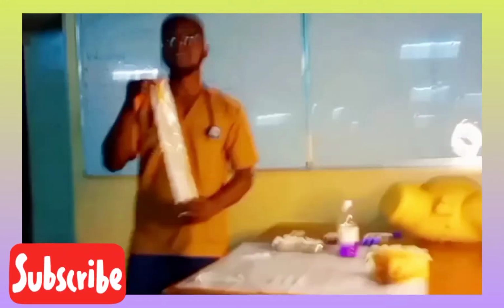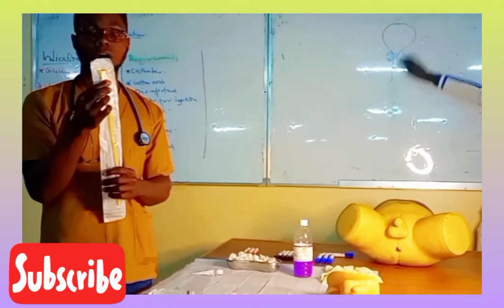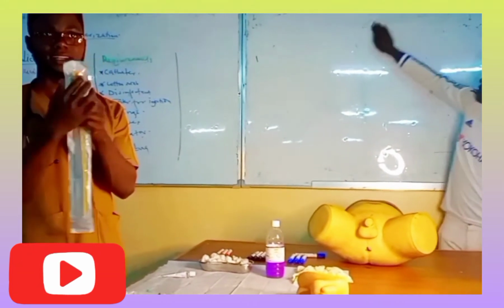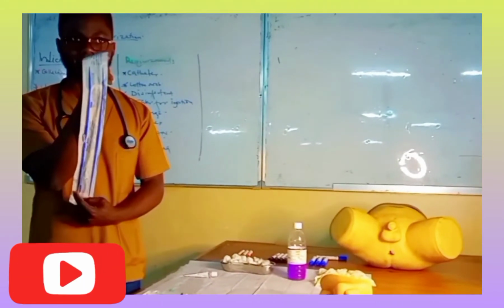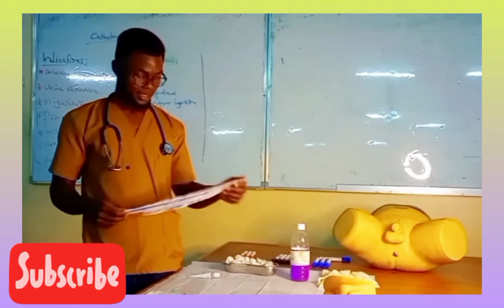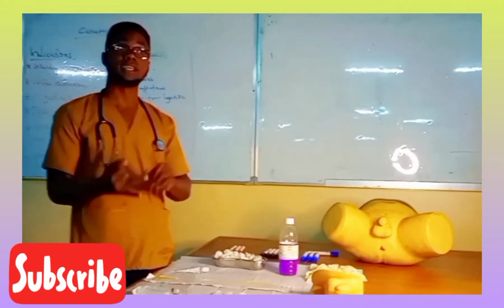A two-way catheter. Why are we calling it a two-way? It has one inlet and one outlet. We have a three-way catheter; it has two outlets and one inlet. But this one is a two-way catheter and it is gauge 16. It means this one fits the urethra of a man and a woman, but not a baby, because it's somewhat big. We have gauge 18, we have gauge 20.